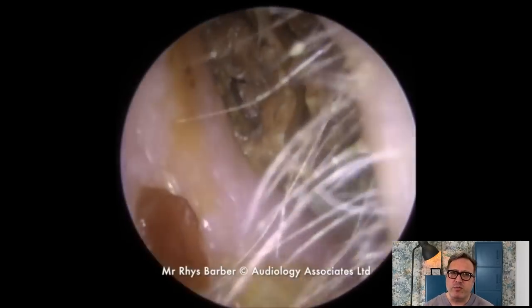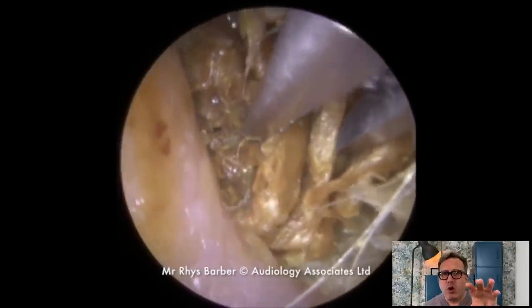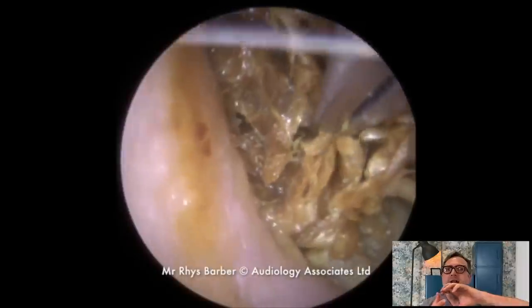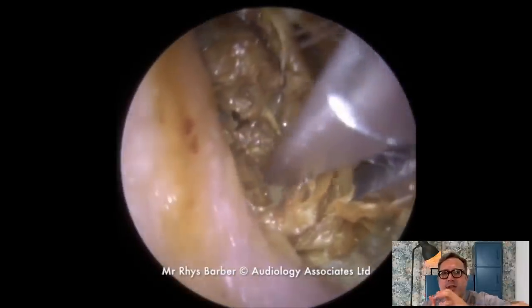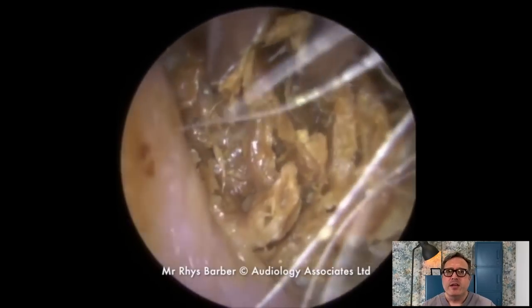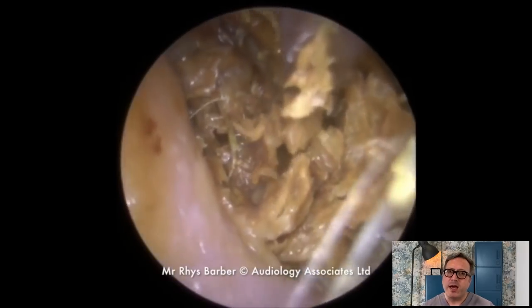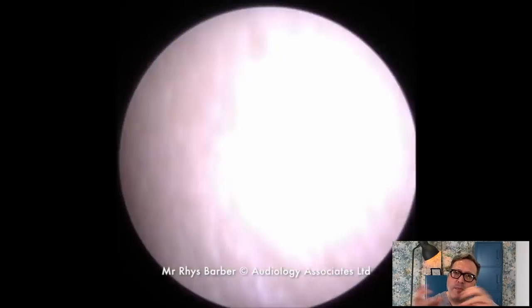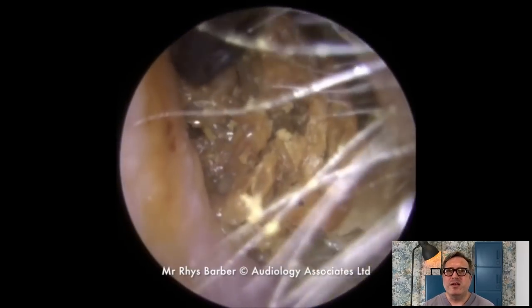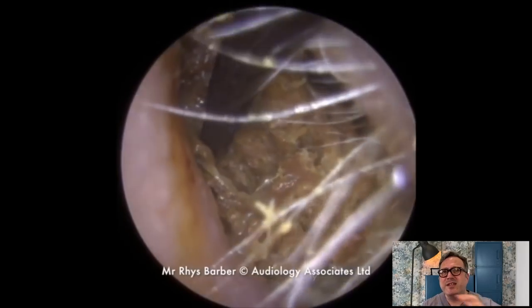Left untreated, keratosis obturans can cause quite a few problems. We were just using the standard size on the tube, but it's not holding onto the skin very well. Imagine this like an onion — you've got layer upon layer upon layer, hardened together, bound and wound and knotted all together in there. So it's not going to come away easily. I'm opting to use the crocodile forceps here just to try and pull apart these layers, tease these sections apart. But the jaw of the crocodile forceps is a bit too thick and it's just slicing through that skin.